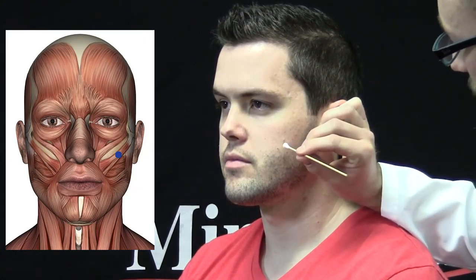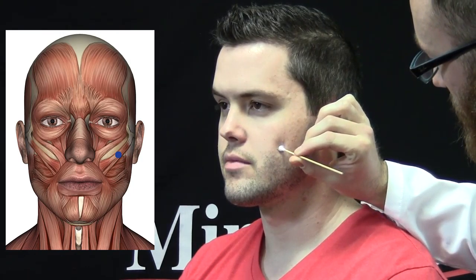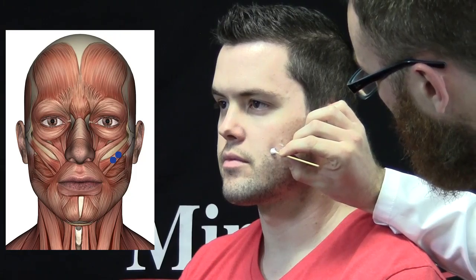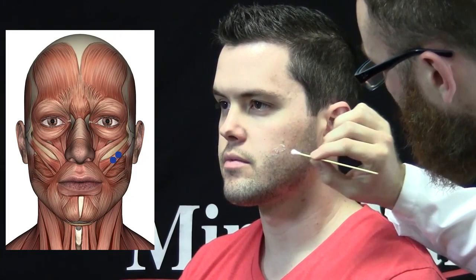When asking your subject to do this, it's important to refer to the motion in terms of muscles, not emotions. The first electrode goes about halfway between the corner of the mouth and the junction where the jaw bones meet. Take a cotton tip applicator and apply a small amount of abrasive gel, then gently abrade the site by twisting it between the index finger and thumb applying light pressure. This will leave a red circle of grit on the site — leave this grit on the skin as it will act as a placeholder. Now abrade the second site about a collar width lower on the same line toward the corner of the mouth. Once both sites have been abraded, take one of the prepared electrodes, remove the final plastic cover revealing the adhesive surface, and with a single motion take a gauze pad, wipe the grit off, and apply the electrode in its place.